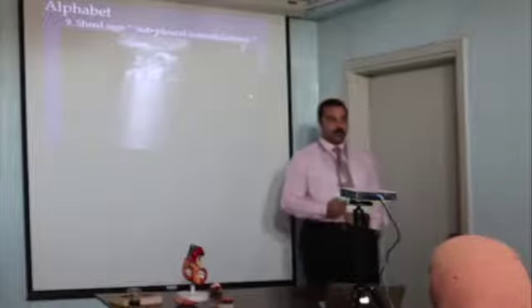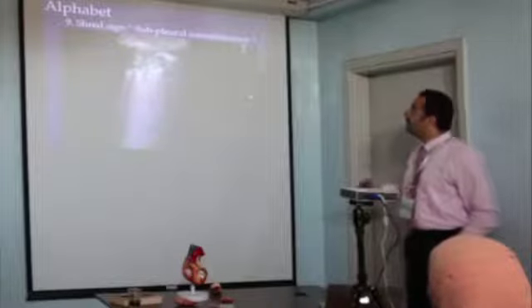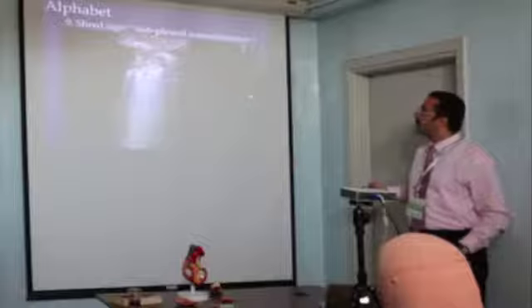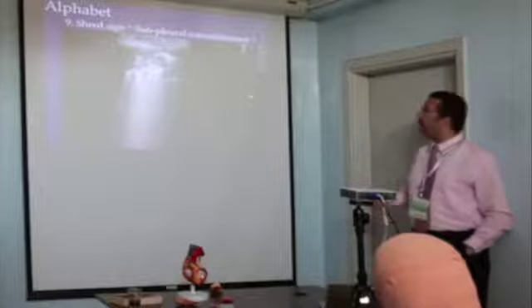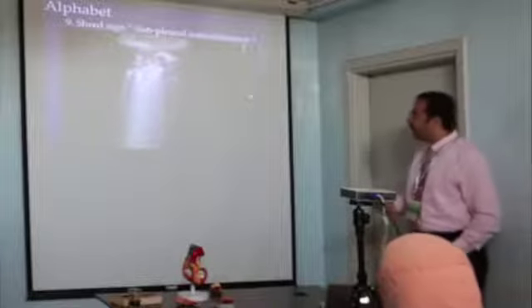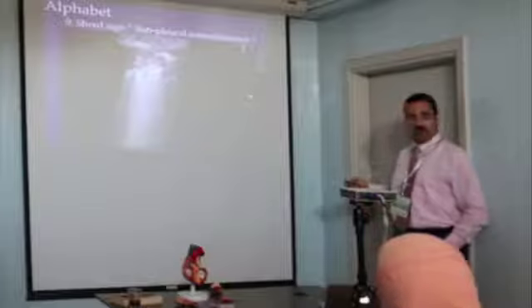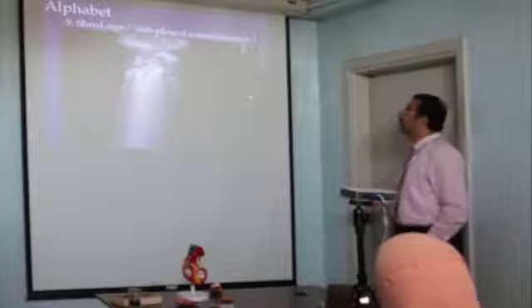Shredded pleura. Pleural shred means inflamed, thick pleura. This is not the typical picture of the pleura we'll see in the hands-on, because it's diseased, inflamed pleura, with subpleural consolidations and some B lines. Some B lines may indicate pneumonia. If you find that with thick pleura, it's not pulmonary edema, it is an indication of infection or pneumonia. We call this one B prime profile or C profile. B prime, because it's not typical B lines with a healthy pleura, or C, because it's consolidation, an indicator of pneumonia.